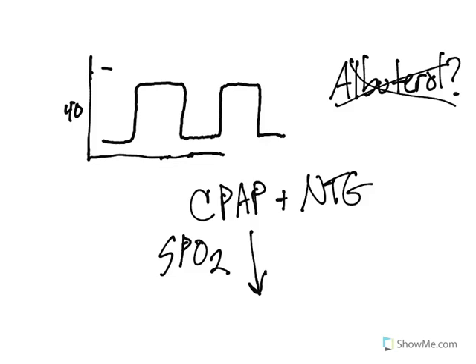It really depends, again, on the disease process, and we can talk more about that a little later on. So this is what I generally expect to see with my CHF patients. Let me write that up here. My CHF patients on my end-tidal CO2.